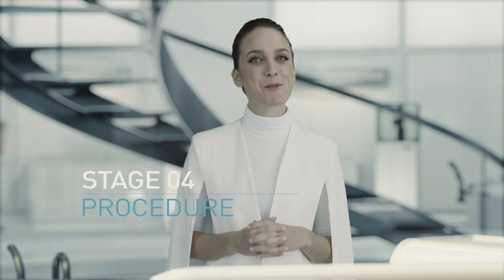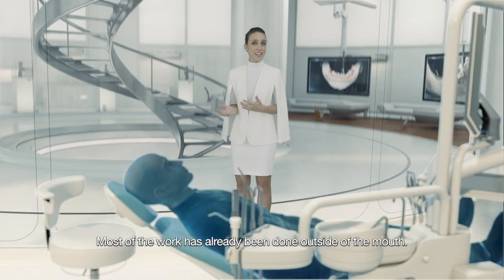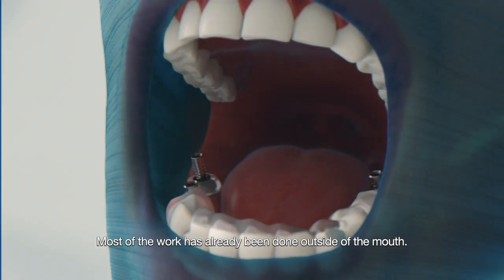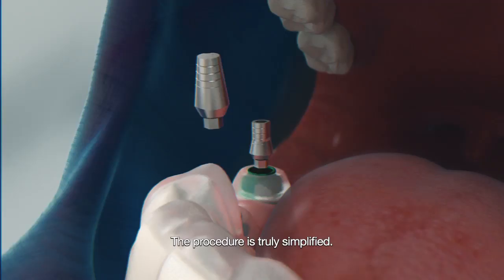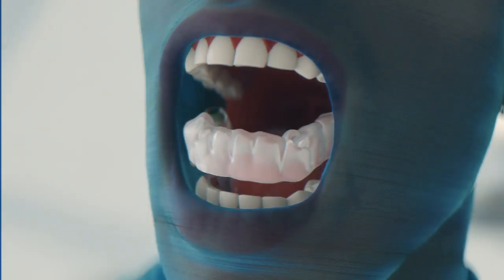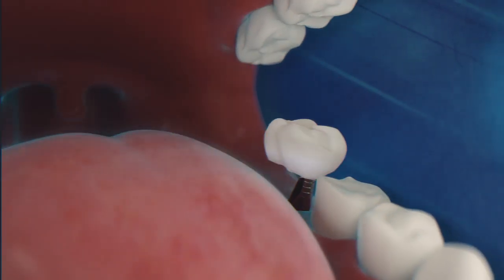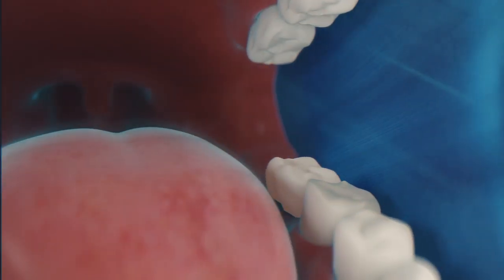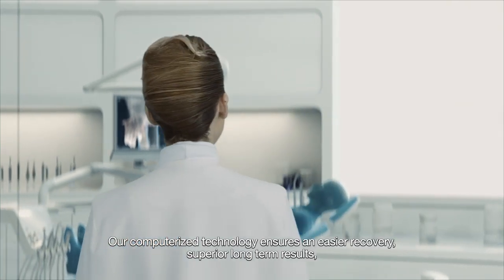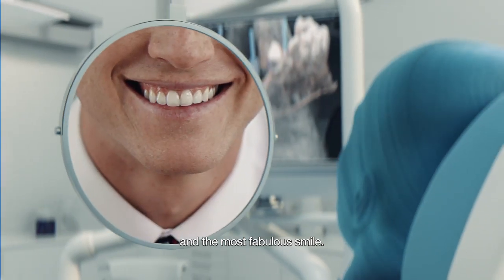Stage 4 – The Procedure. Now the doctor is more than ready. Most of the work has already been done outside the mouth. The procedure is truly simplified. Our technology ensures easier recovery, superior long-term results and the most fabulous smile.